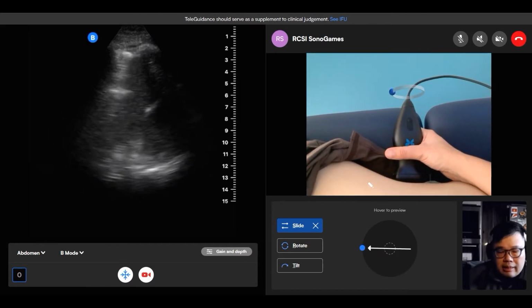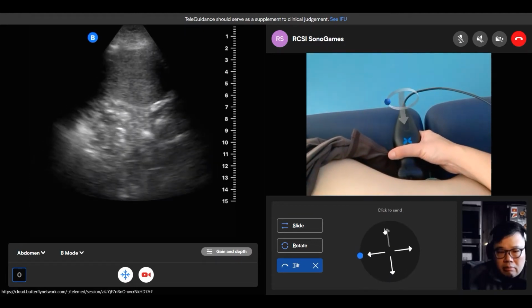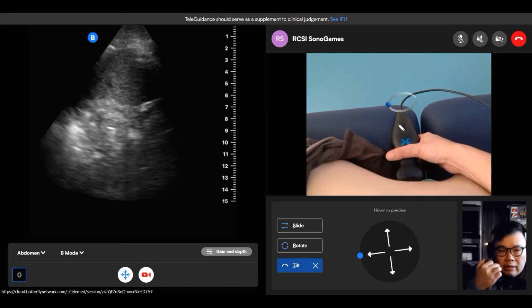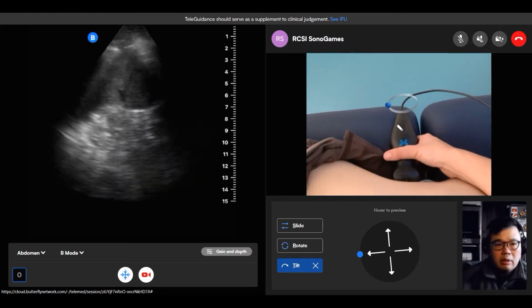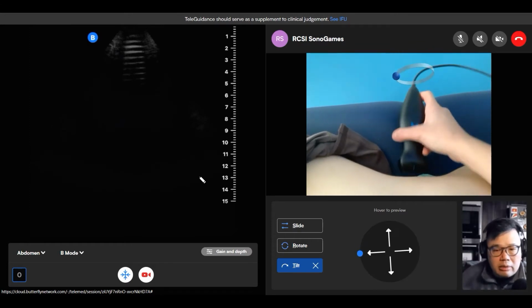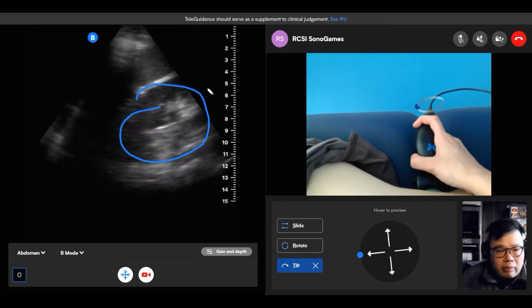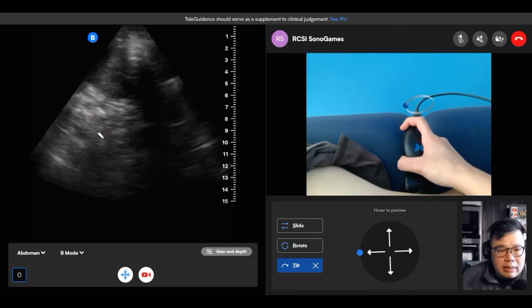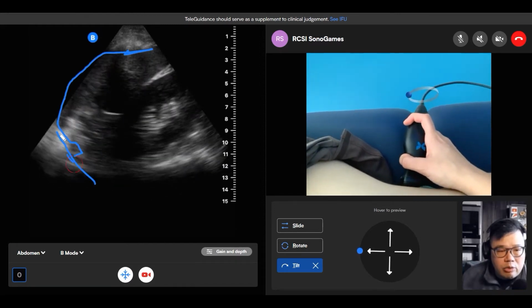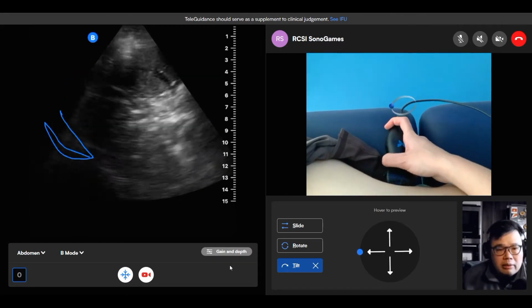But at the same time, tilt the probe downwards a little bit. Yeah, exactly. So you need to go posterior and then tilt it forwards. So is that doing it? Yeah, so if you just fan it a little bit, like tilt it back and forth a little bit, so you can see the kidney in this space here. I think that's kidney there, yeah. So his spleen goes up there and then comes around here. So you can see the diaphragm over there. You want to make sure that there isn't free fluid up there.